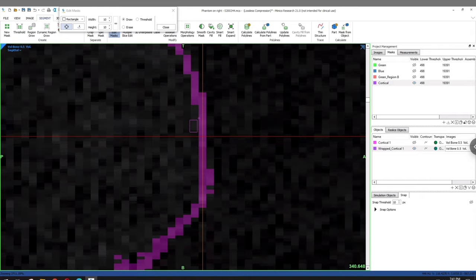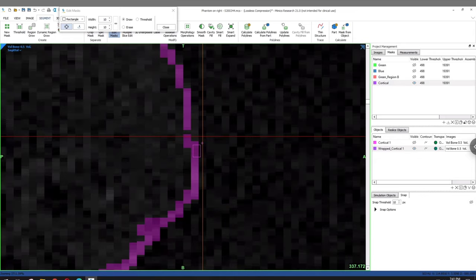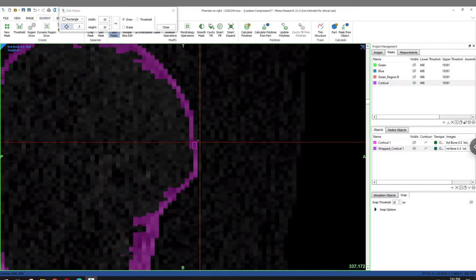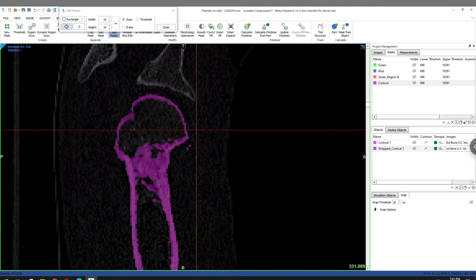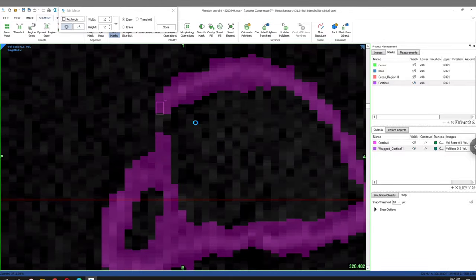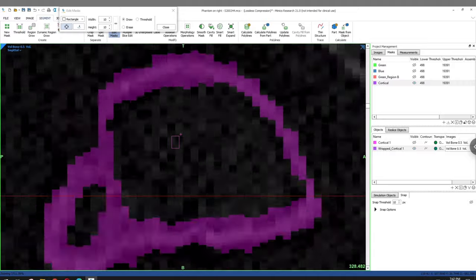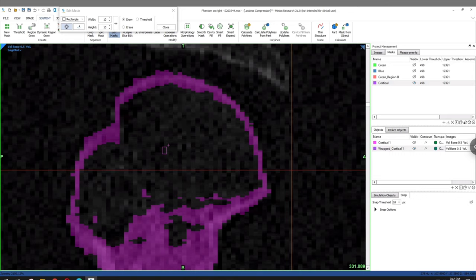So you're going to have to repeat the process that you originally did with the coronal plane, or whatever primary plane you were working with, for these next two planes in order to ensure that you really do have a full cortical shell. As is evident here, some of the gaps are actually going to be quite large. So I would suggest that you double check as best you can to ensure that you really do have a cortical shell, as it'll be imperative when we decide to fill in the trabecular interior that you have a fully defined cortical shell.